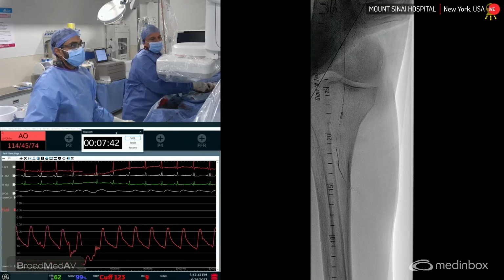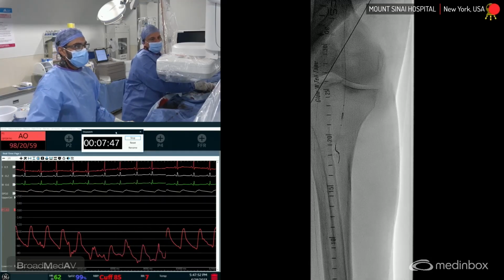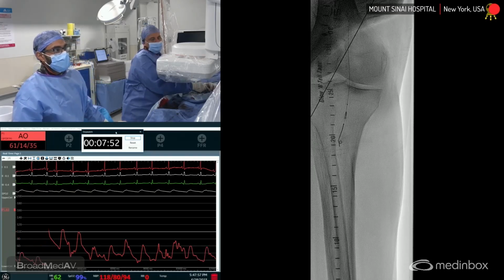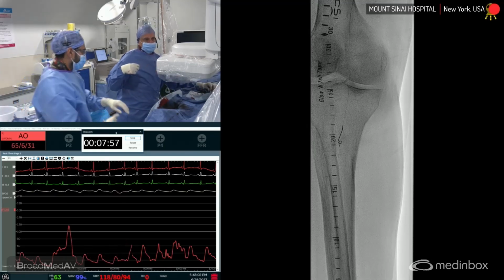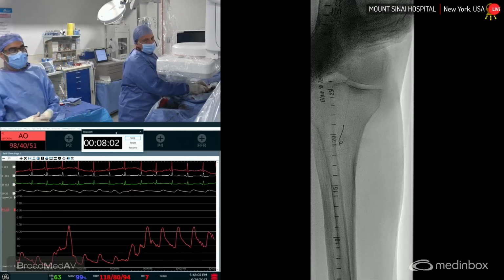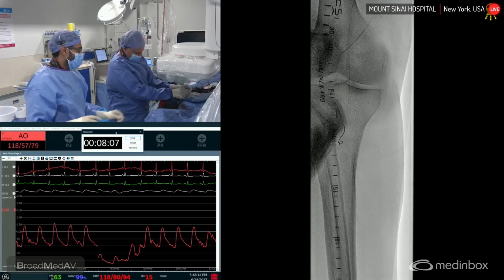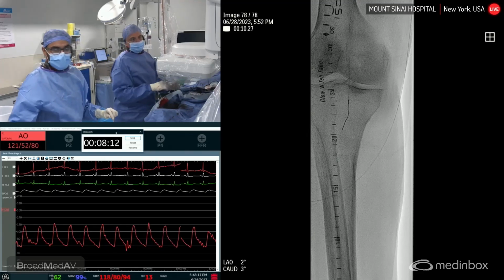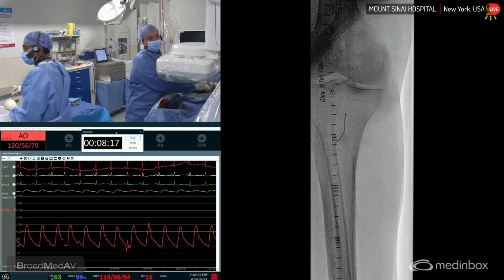Maybe Ibrahim can talk about how important vessel prep is. Yeah, the Supera system is nitinol wires that are woven together, and once you deploy it, it's pretty much deployed. There's no real post-dilating it, and the radial force is quite excellent. So you want it to deploy nominally. The only way to get it to deploy nominally with the proper radial strength and no compression and no elongation is to really prep the vessel well. When you're deploying the stent, it's almost like you're deploying it outside the body. It just deploys as it's made.